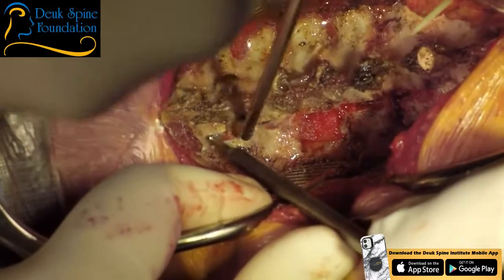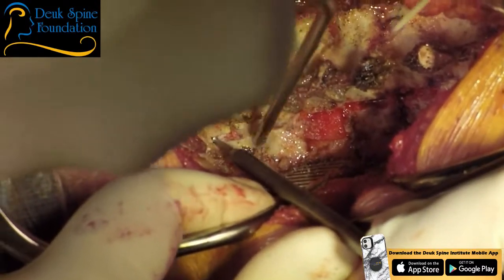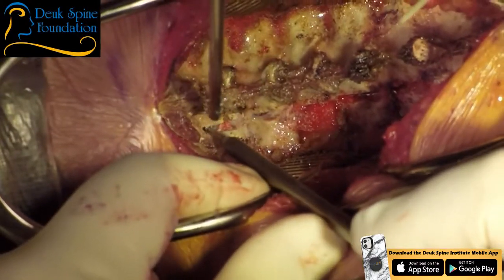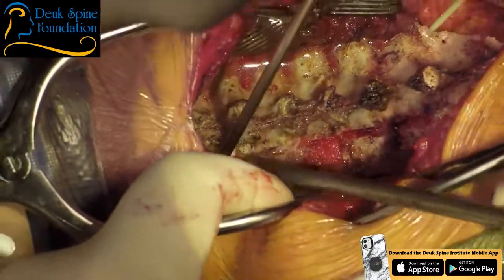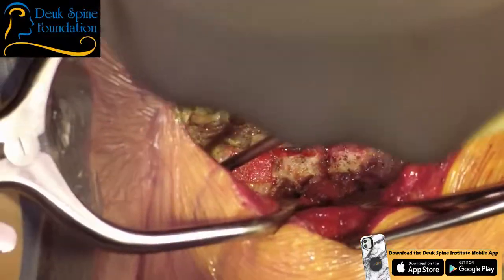Suck, suck. I'm almost done here on this side. I'm going to switch sides. This is the most cautious area, right? What happens if you injure the cord at C3? Your patient becomes quadriplegic and requires a ventilator the rest of their life. So that's really bad. I've never done that, never will.